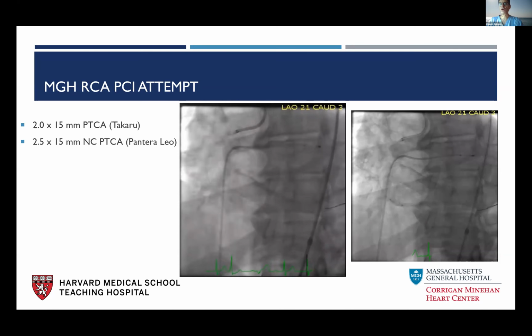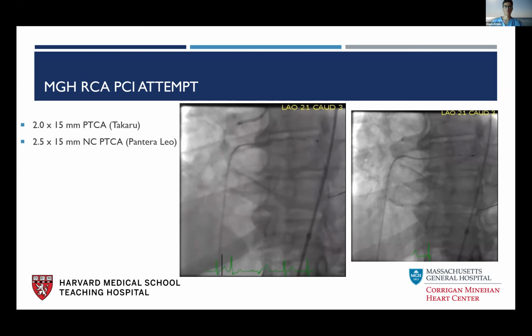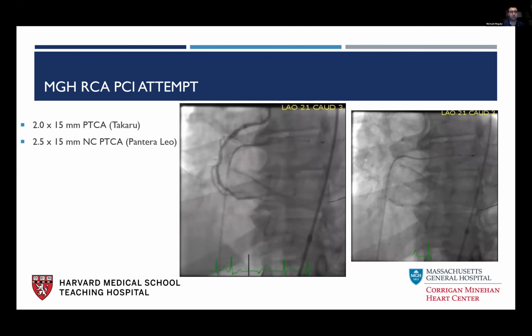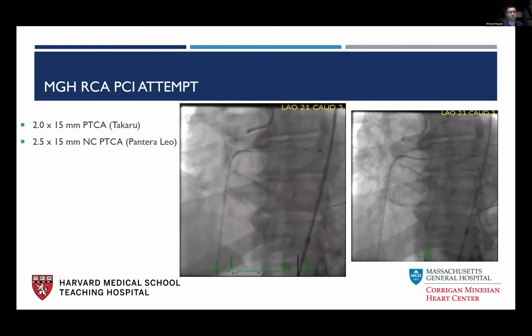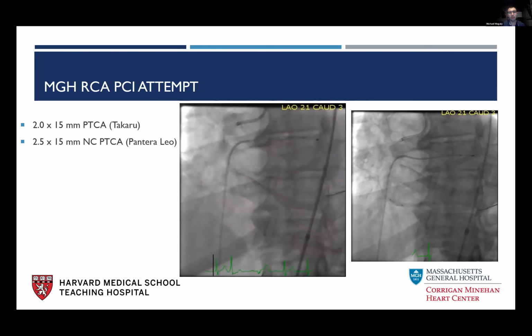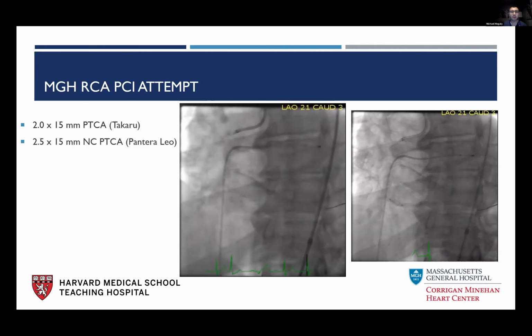Perfect. And Michael, any other thoughts about this? Would you have done anything different? Are you happy the way things evolved? Maybe the only question that would be raised right now is, in this uncrossable lesion, and I know we kind of did it before, can we use CSI to cross an uncrossable lesion, or do we prefer forward atherectomy with Rota? Rota was very reasonable here, but it's just a thought-provoking question. Would CSI have worked?